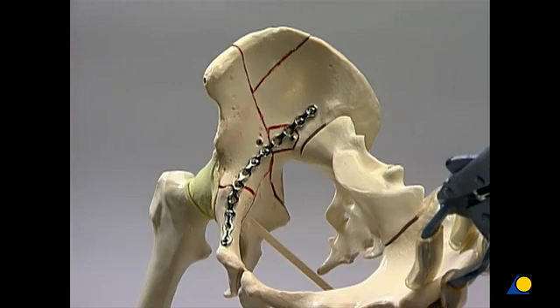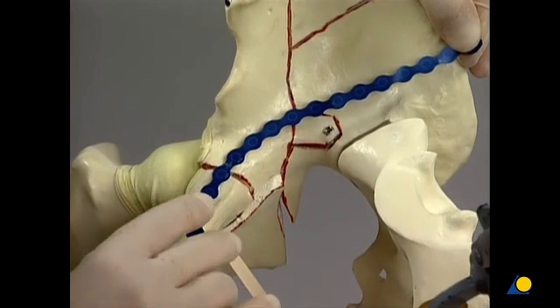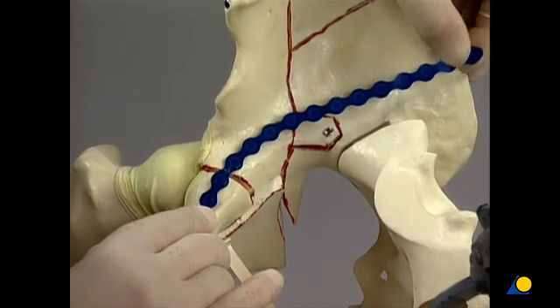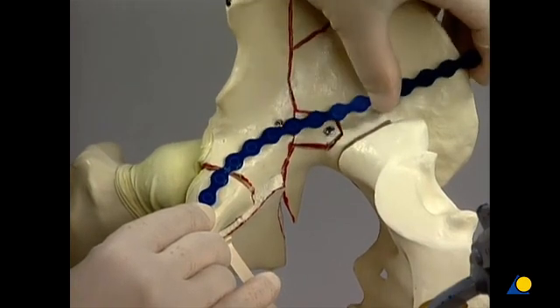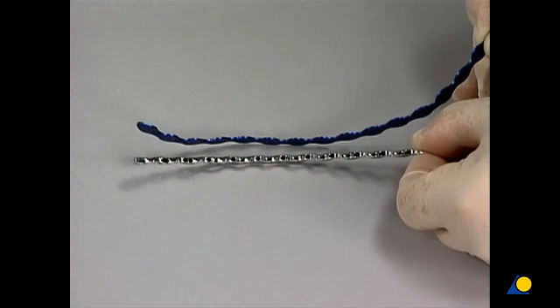A 12-hole 3.5 J-shaped reconstruction plate is contoured to fit the pelvic brim. The plate must be long enough to provide adequate fixation of both the posterior and the anterior fractures, and is usually extended to the pubic body. The bending template is moulded to the bone so that the contours of the bone can be transferred to the plate. The anterior column runs from the anterior to the posterior aspect of the pelvis — it is concave, then convex, and then concave again. The bending pliers are used to contour the plate.